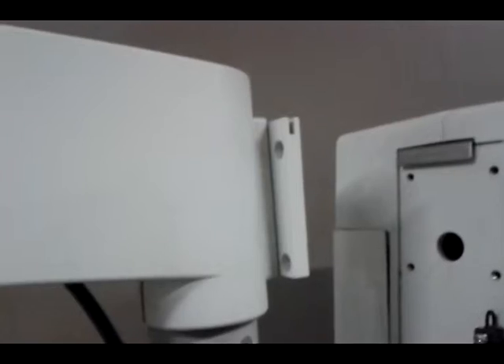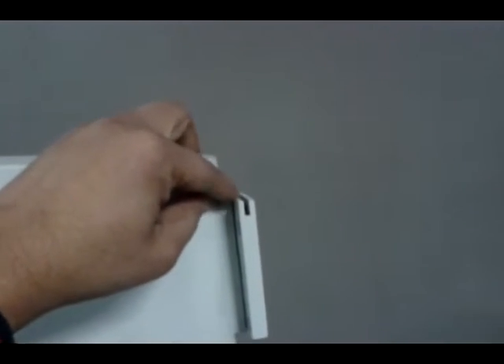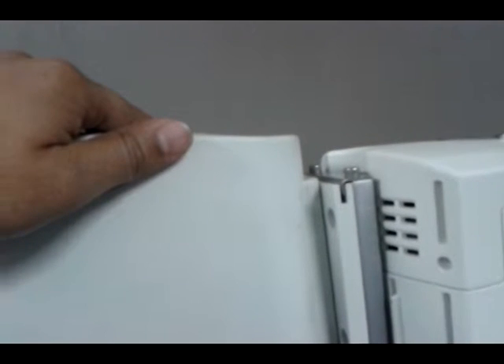Now lift the power supply like this. There is a slot given which we have to match with the power supply. Now it will be fixed like this. After that, secure the screws from both sides.